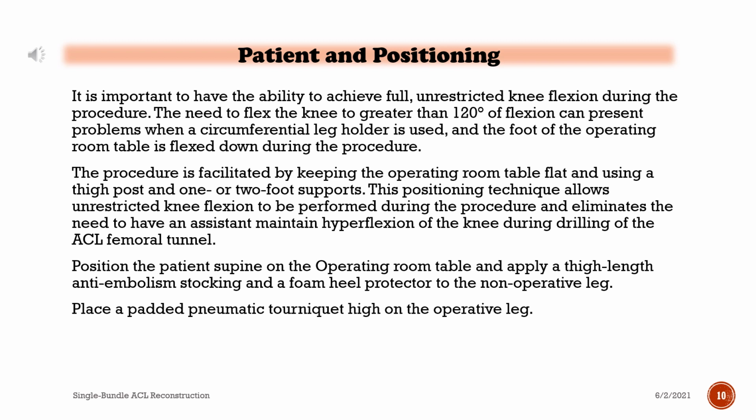The procedure is facilitated by keeping the operating room table flat and using a thigh post and 1 or 2 foot supports. This positioning technique allows unrestricted knee flexion to be performed during the procedure and eliminates the need to have an assistant maintain hyperflexion of the knee during drilling of the ACL femoral tunnel.